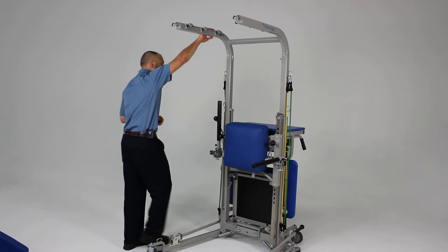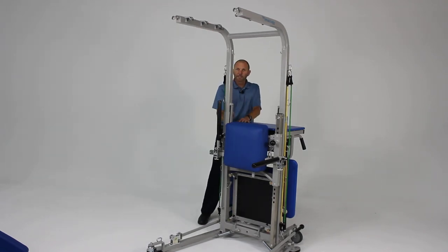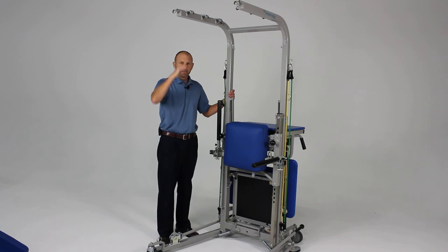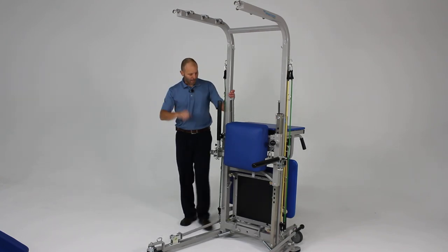The upper support arms can be raised and lowered by pulling a lever on the side, raising them about four to six inches. This allows for different heights for patients, but also allows you to lower the unit to get through doorways that are not so high.